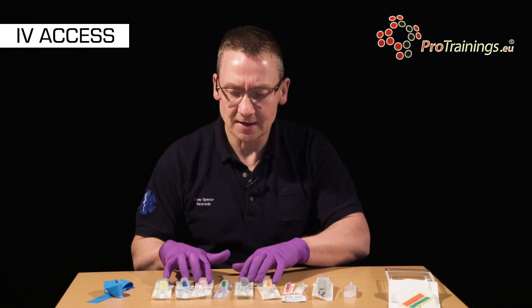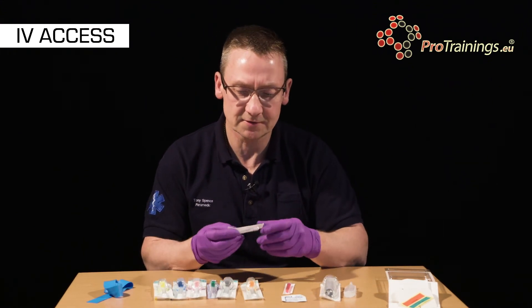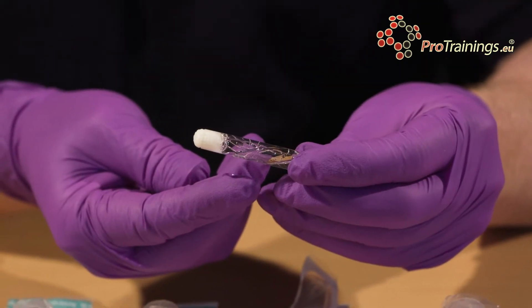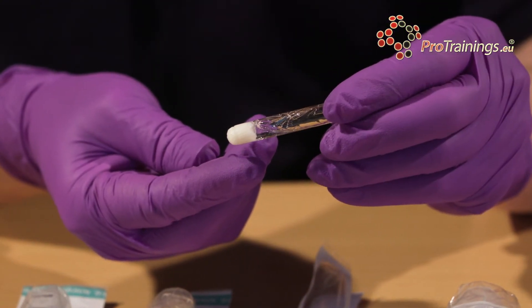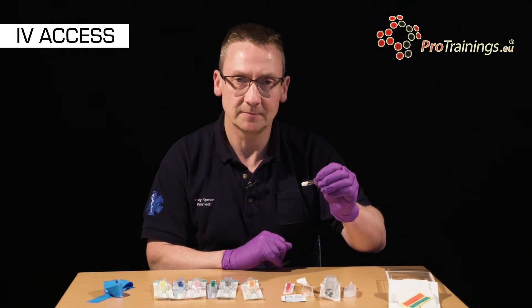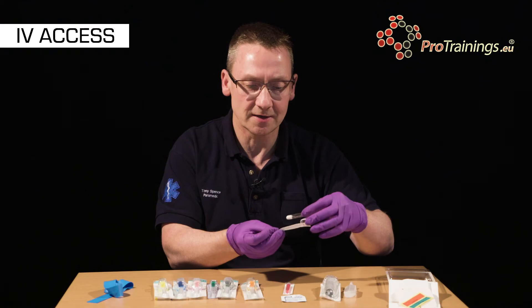Before we insert the cannula we need to prepare the area, and there are a number of various products available. This one is chlorhexidine and it's in a glass vial which we open — we break the glass and that allows the fluid to be soaked up into the gauze. We use this to prepare the patient's skin. It's important that when we've applied this to the patient we do allow it to dry.